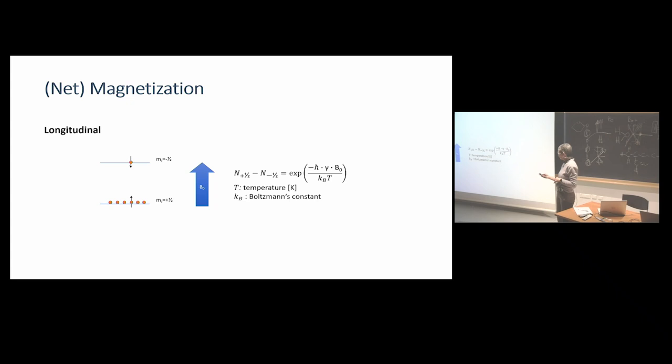But MRI has its downsides. Its main downside, I would say, is that it's slow, of course, but then also that it's not very sensitive. We see about 5 out of 100,000 of these hydrogens at a magnetic field strength of 7 Tesla. So we cannot see many of them. What do we see then? Well, we cannot really see this either, meaning that if you put a water bottle inside the scanner, you won't have any signal. Nothing happens. You will just have this splitting of the energy level, but you can't see anything.